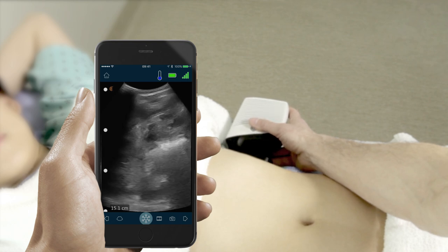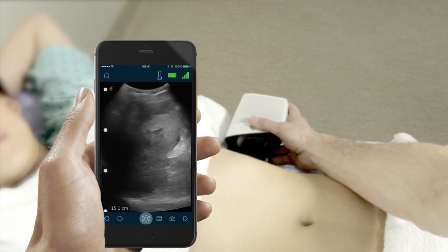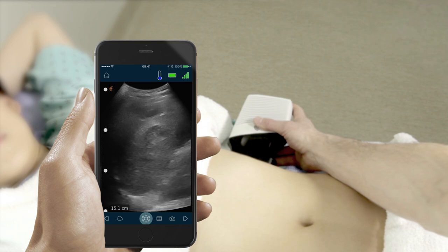And so it would be important to know whether or not there is such an injury before you send them to hospital. And it'll help to decide by what route they go.